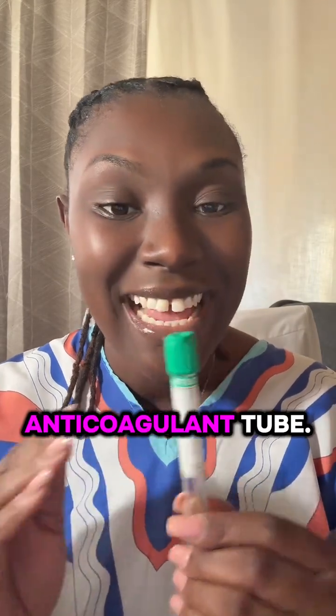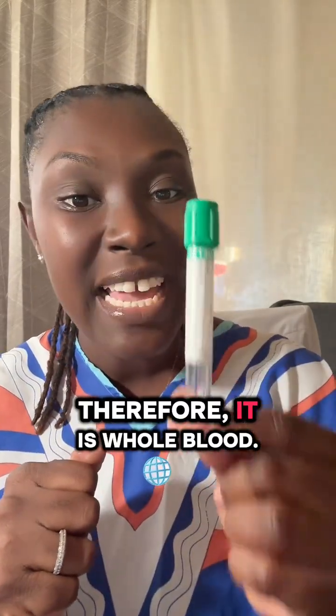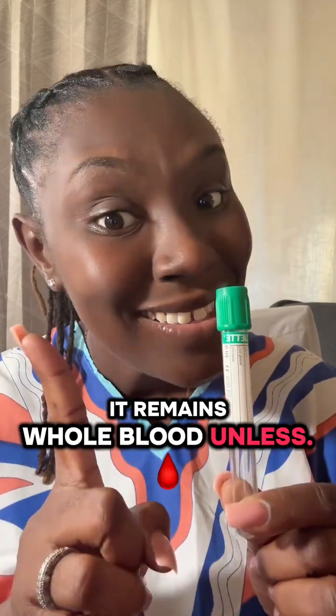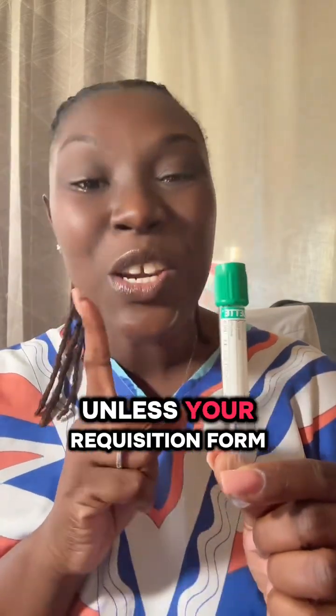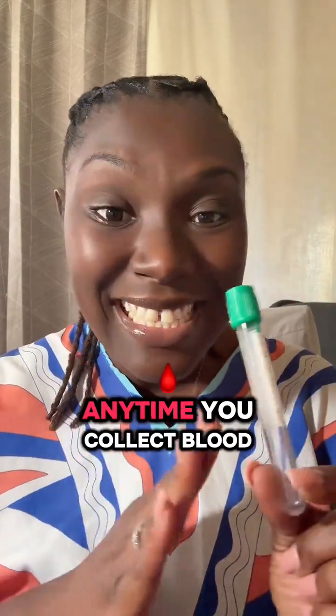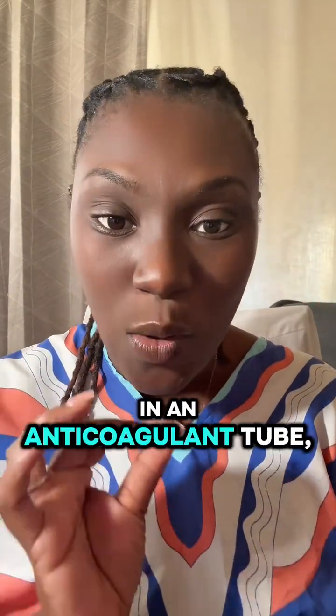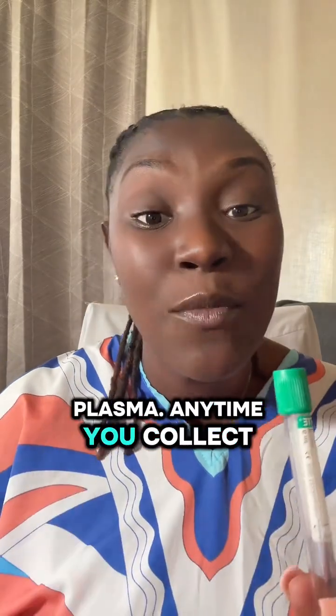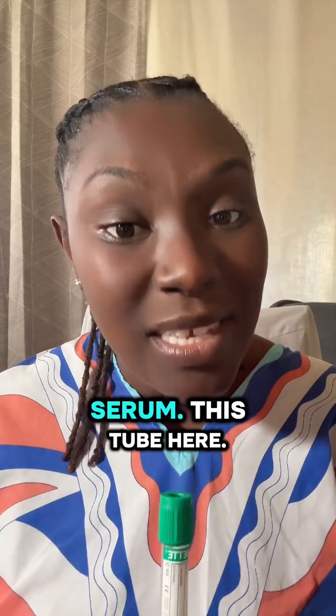This category is an anticoagulant tube. Therefore, it is whole blood. It remains whole blood unless your requisition form says, hey, I want you to get this green tube, but I want plasma. Remember, anytime you collect blood in an anticoagulant tube, it will give you plasma. Anytime you collect blood in a clotting activator tube, it will give you serum.